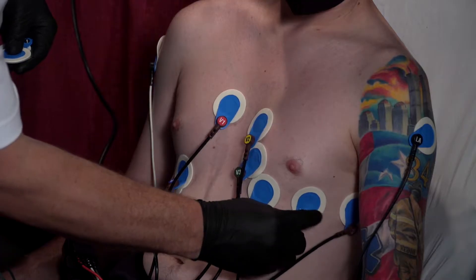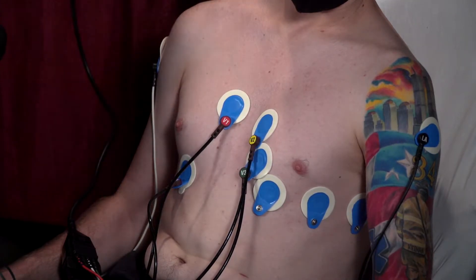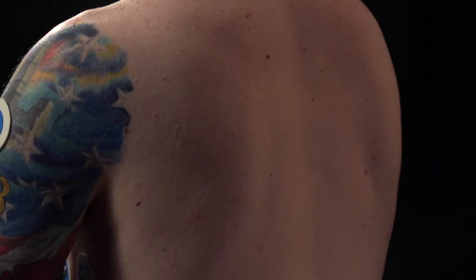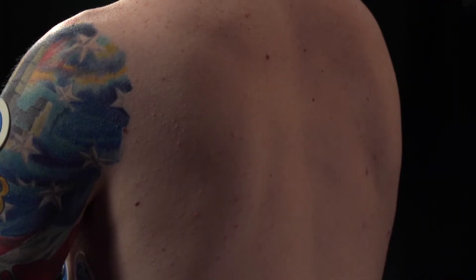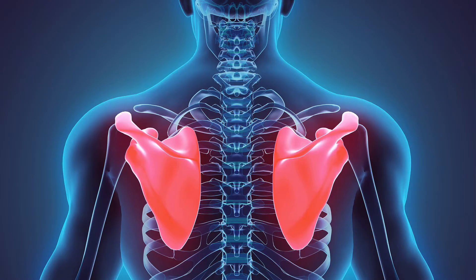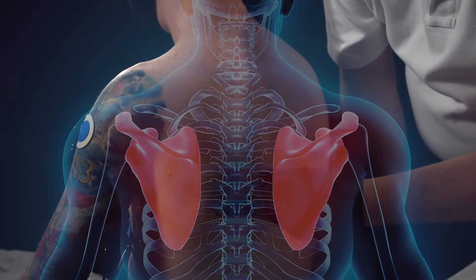Now that we've got V4R, we're going to go to the patient's posterior. We're going to disconnect V5 and V6 at the same time and move to the patient's back. Lean the patient forward and then locate our anatomical landmarks — specifically the patient's scapula and the angle of the scapula where it starts to angle laterally.